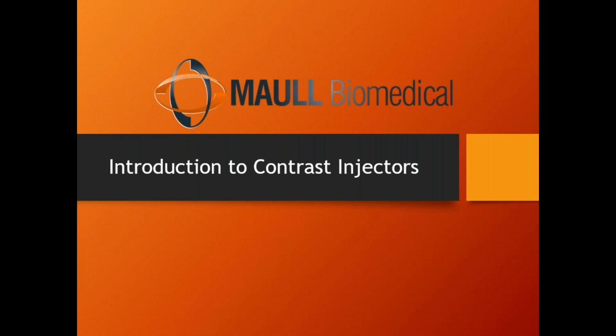Now, blood vessels are neither thick nor dense. X-ray photons have no trouble passing through a blood vessel, so blood vessels don't typically show up on a typical X-ray image, which most of the time is fine. Most of the time when the patient's getting an X-ray done, I'm not looking for blood vessels, I'm looking for broken bones. But sometimes I do want to take an image of a patient and I'm looking for the blood vessels.